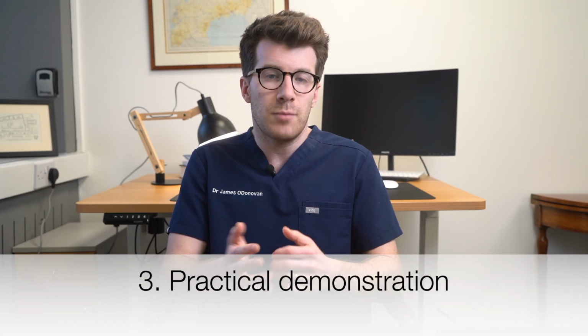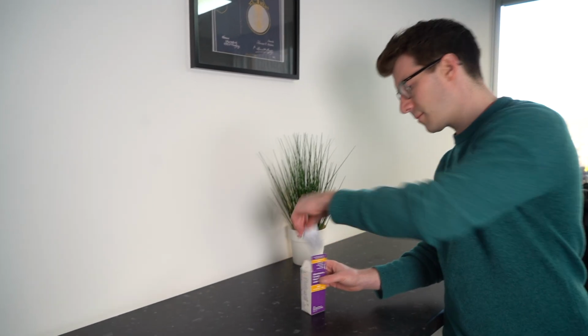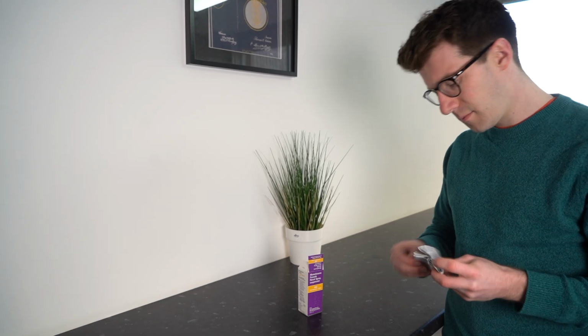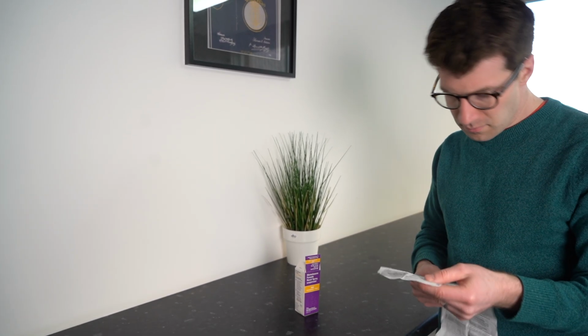So now we know what steroid nasal sprays are and some important things that you should be aware of before using them. Well, how do you use it? For this section of the video, I'm going to take you through a practical step-by-step demonstration where I demonstrate this on myself. First, take the medication out of the box and read the information leaflet fully before using it. Every spray is different and will have slightly different instructions. If you're unsure about anything, you can speak to your pharmacist first.